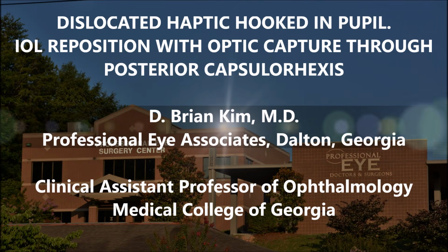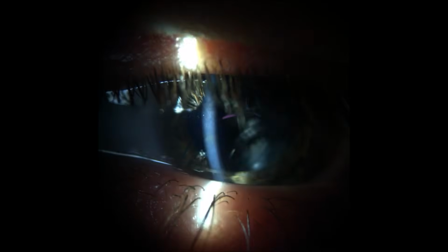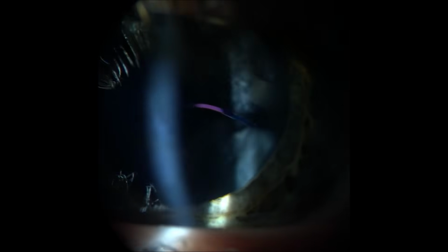I'm going to share with you this case of a patient who was referred for a dislocated IOL. And you're going to soon discover how this case is a little bit unique from other dislocated IOLs I have had. What I mean by that is this dislocated IOL haptic is hooked within the pupil. As you can see, this is a patient at the slit lamp. And if you pay close attention, the lens is dislocated inferiorly. You can see one of the haptics is hooked on the pupillary edge, like a fishhook. And so this patient has a tilted, dislocated IOL inferiorly, and we're going to go ahead and fix this.